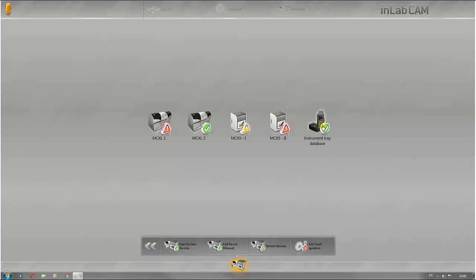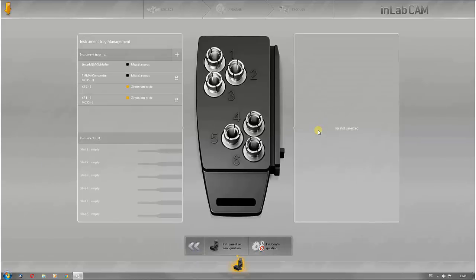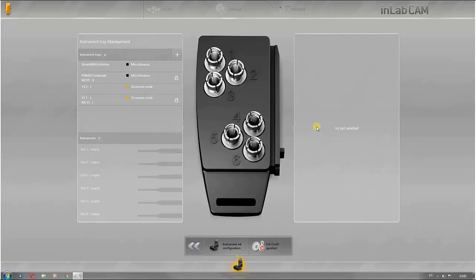Under instrument set configuration, the instrument trays for the InLab MCX5 can be managed. New trays for the InLab MCX5 can be created here. In addition, all instrument trays which have already been created are displayed.